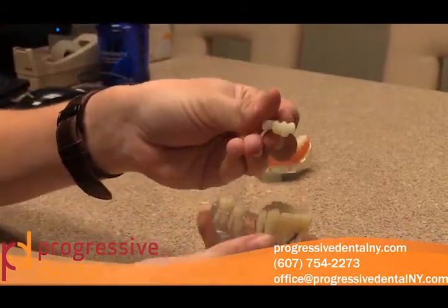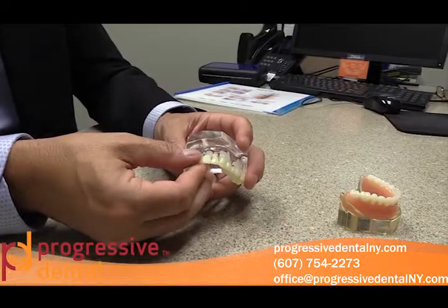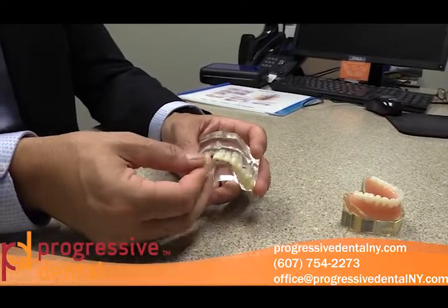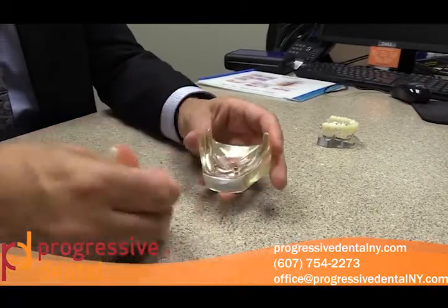An implant ultimately becomes a new tooth root. If you take a tooth, it has two parts: the top, which is the crown, and the bottom, which is the root. That comprises a tooth. When a tooth is gone, it's fully gone. The implant is like putting a new root for a new tooth there. Whether it becomes a single tooth, an anchor for a full dentition, or part of an apparatus that a denture gets connected to, that implant serves as an anchor.